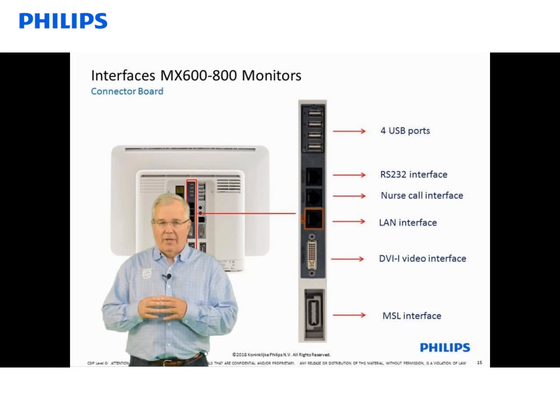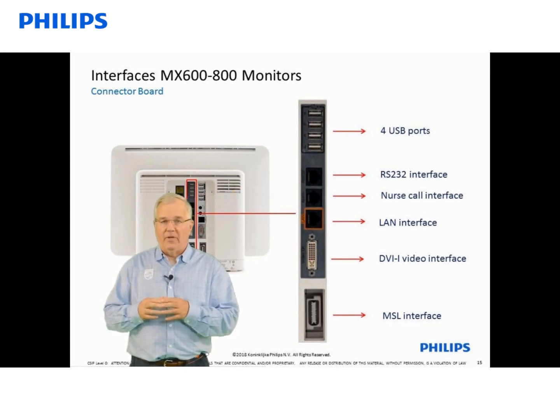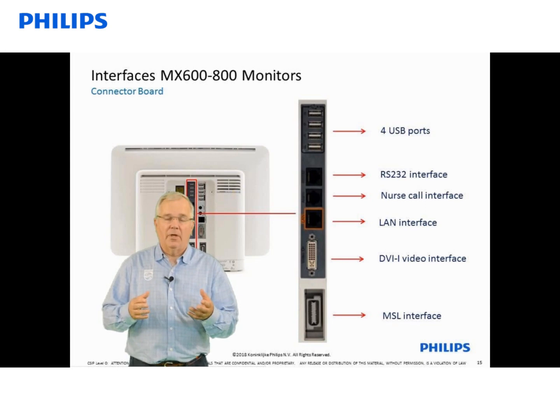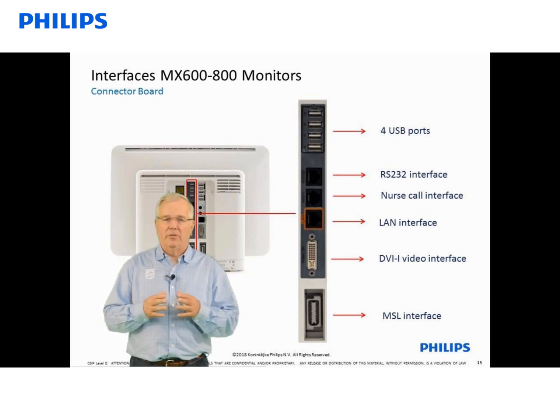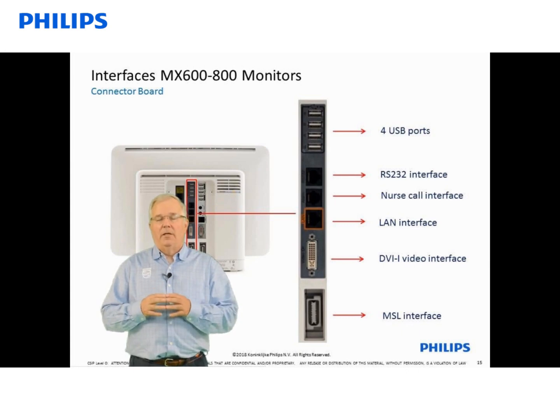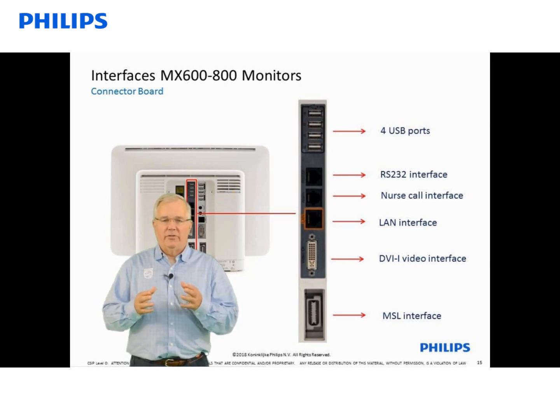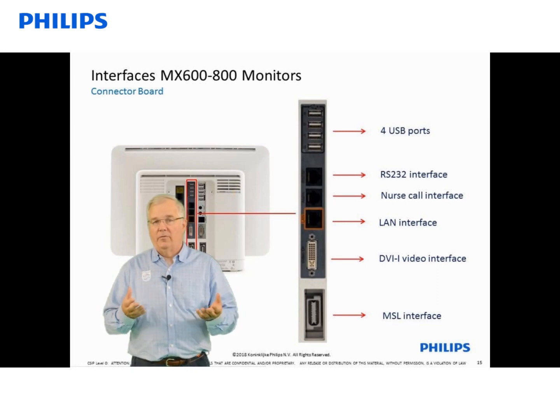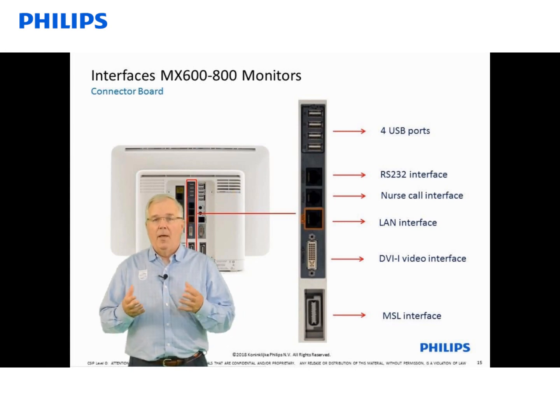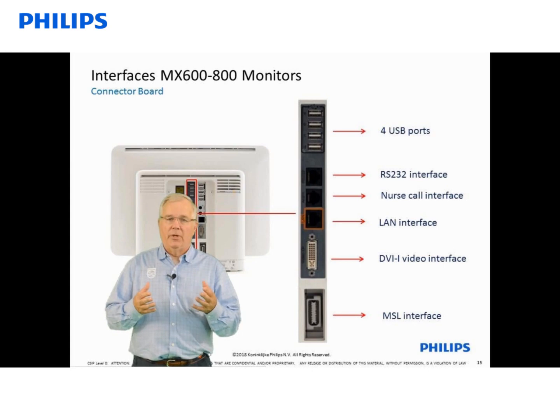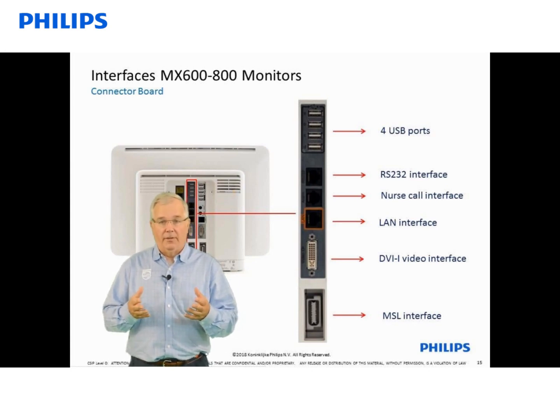Next is the network connector. Just like in the 400 to 550, this is where we connect the network cable and it allows the monitor to show its information at a surveillance station. Below that is our DVI connector — very similar and same functionality as with the 400 to 550. I can have a slave display with the same resolution as on my primary screen.